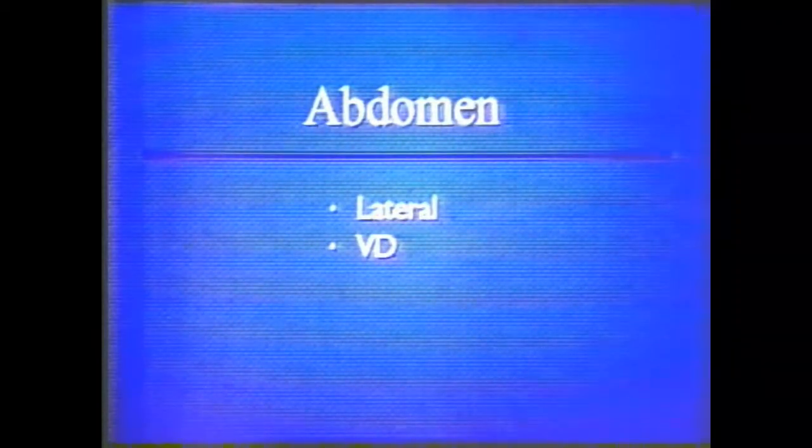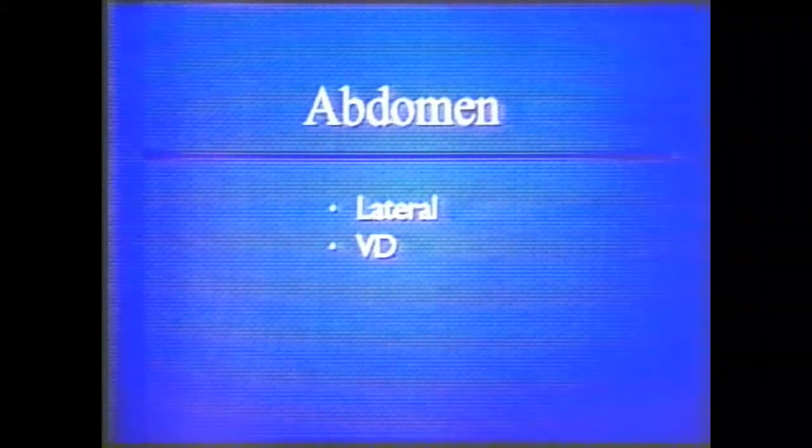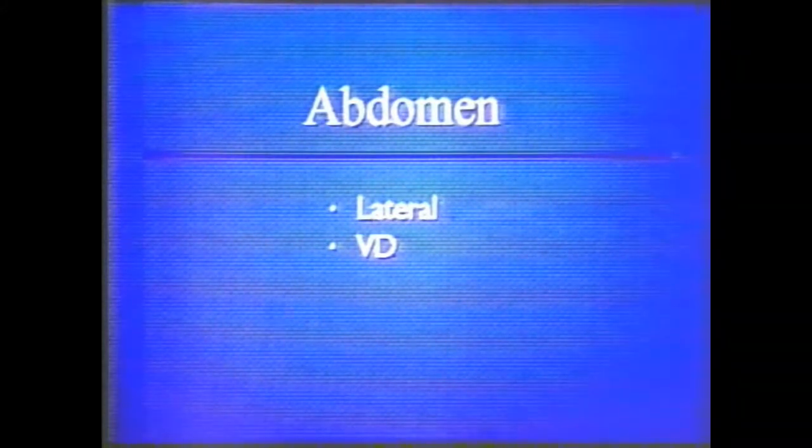The positioning of the animal to obtain abdominal radiographs is almost identical to the thorax, except that the center of the beam is over the abdomen. Care must be taken to obtain true laterals and VD radiographs. DV radiographs should be avoided. The films are made on expiration because of a longer quiescent period, which allows for the exposure without movement.